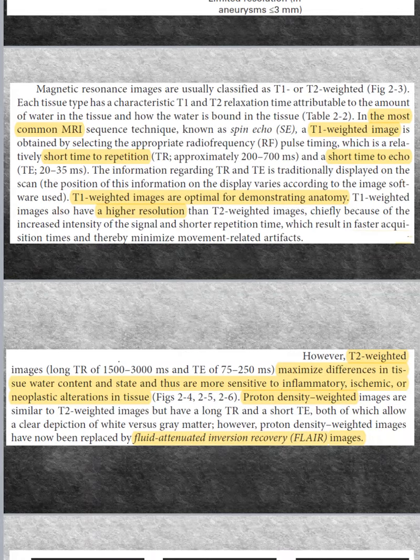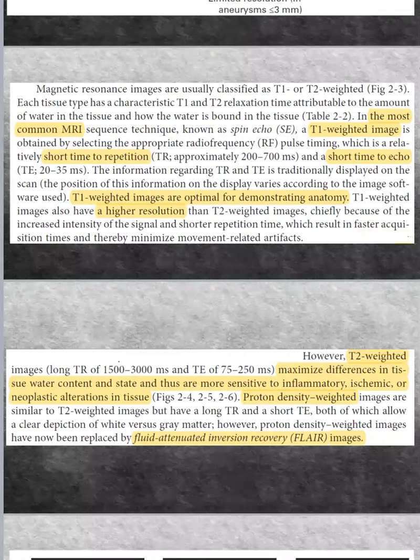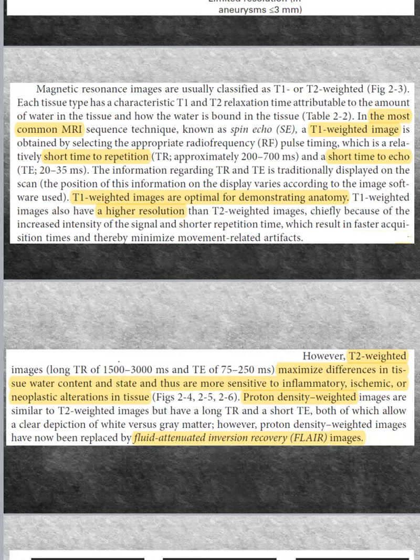Okay, so the T2 is sensitive to the areas of water content. If I have water content, I'll get hyperintense. But what do you think of the difference between them, T1 or T2? Which of them has higher resolution, T1 or T2? T1, yes. So it is better in demonstrating the anatomy.